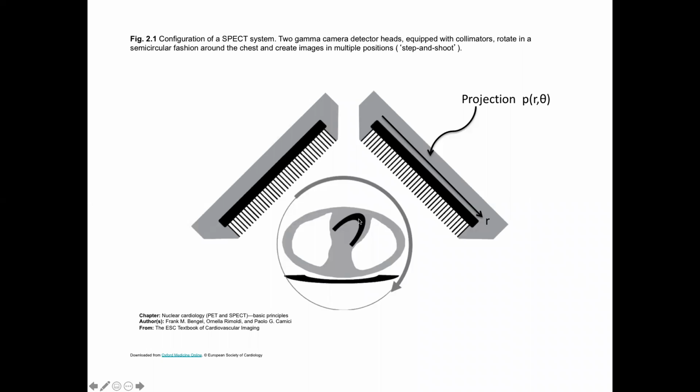And we're going to get a stack of these, which are the different slices of the patient, okay? So here, this is Z or the slice direction, this is the R direction. And then as I go across here, I see it gets brighter here, gets darker, gets very bright right here, darker, bright, etc. So that's the profile in terms of how that's organized spatially.